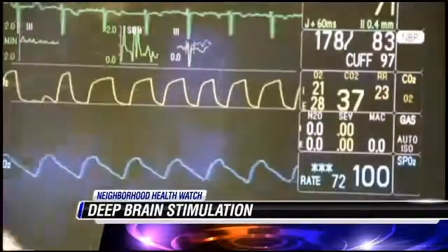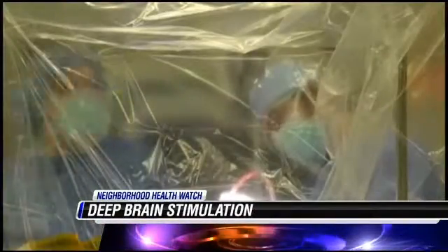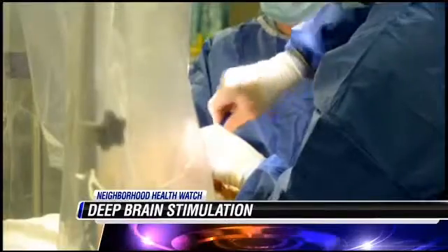Are there any benefits to the patient being asleep rather than awake? Right. The obvious benefit there is in traditional DBS, the procedure is actually done with the patient awake through the entire procedure. So they're in an operating room setting, having a brain surgery done awake. But for some people, that's a difficult idea to palate, and so this is an option for patients to allow them to undergo deep brain stimulation while they're asleep through the whole procedure.